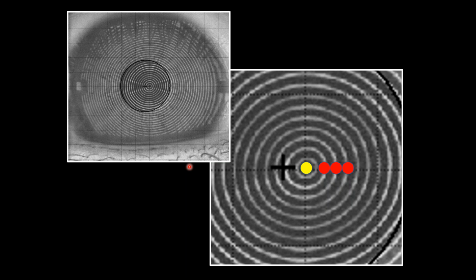So what you're going to do is have the patient start out 1 ring nasal and look to see if the Placido has left the conj and moved onto the cornea. Does it look balanced on both sides? If not, then go to 2 rings. If not 2, then 3. If not 3, then 4. So change their fixation. Patient always looking in or looking nasal.